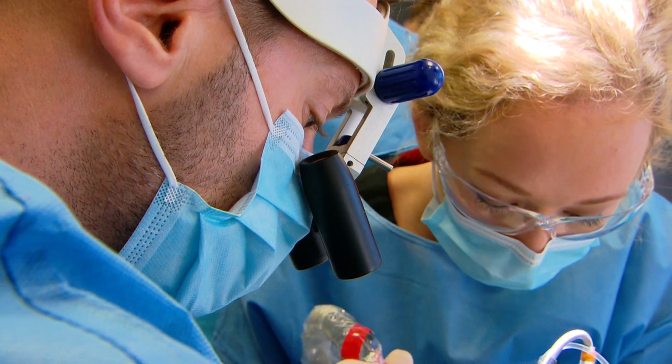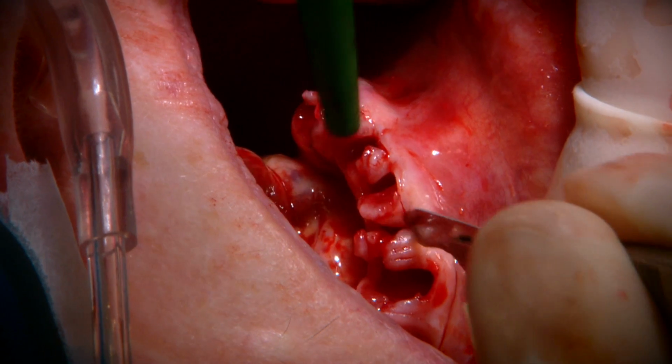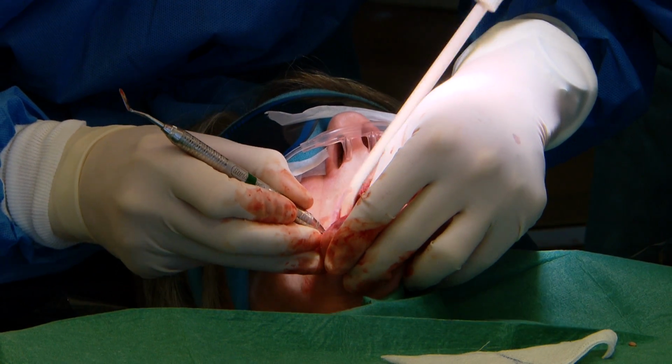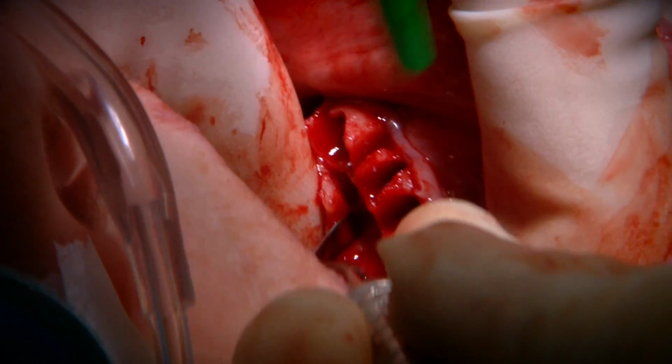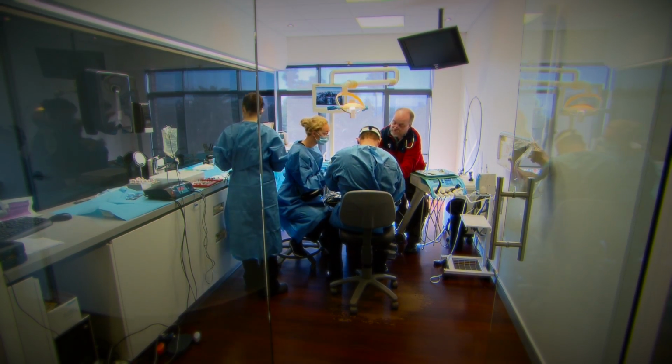The next thing we need to do is remove this sort of infected gum that's been between the teeth, and we need to just expose the lower jawbone, or the mandible, which is obviously where we're placing our implants. The next vital stage, when we're doing it all-on-4 in the lower, is there are 2 nerves.